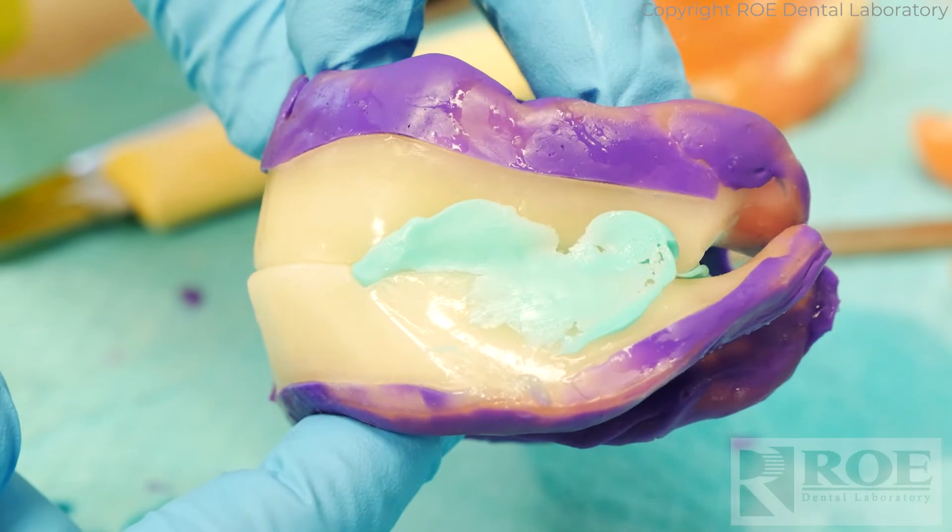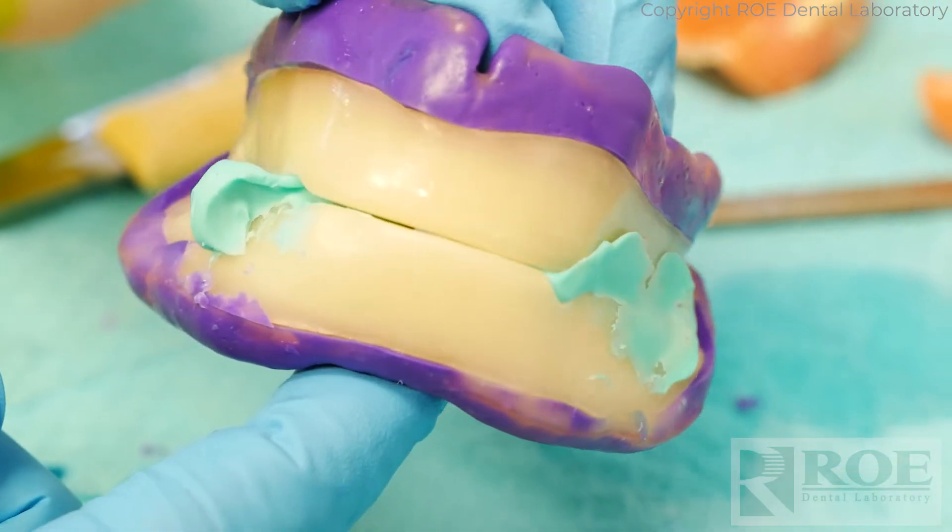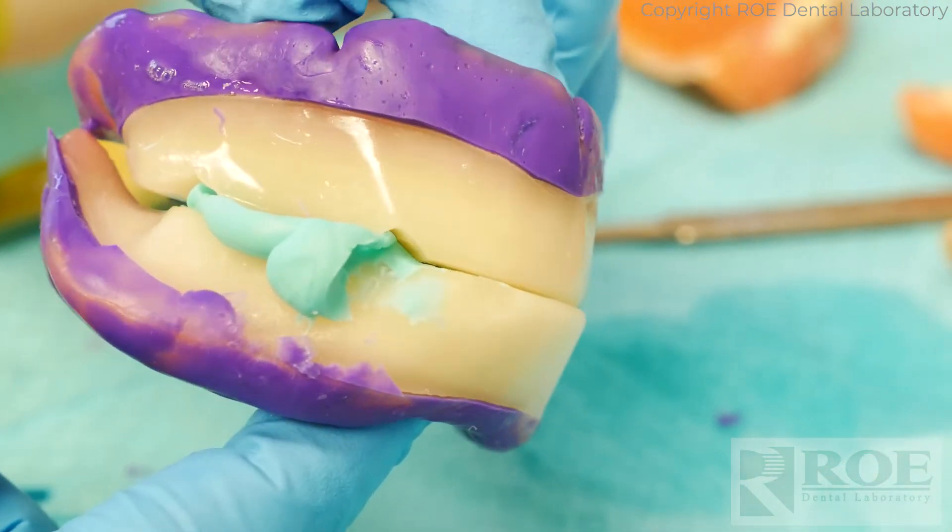Then simply capture bite and photographs while the bite blocks are in the mouth. We want full face and full smile — that way we can set the teeth behind the lips in the proper place.